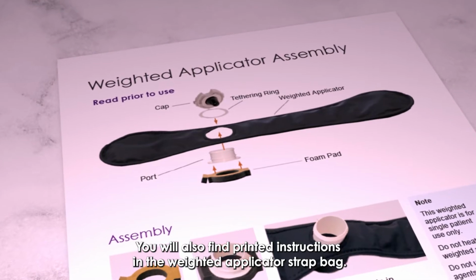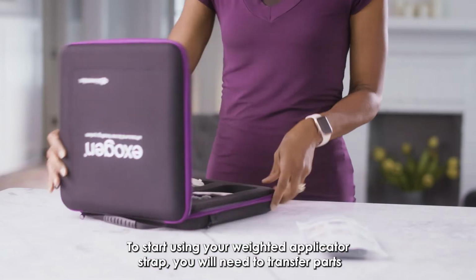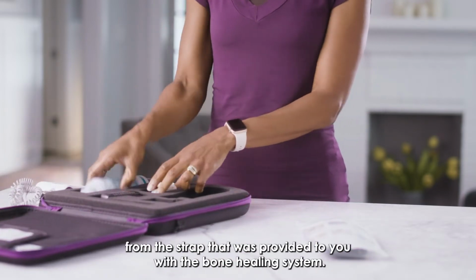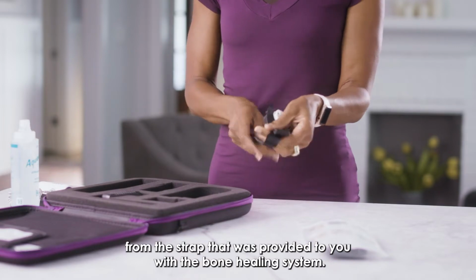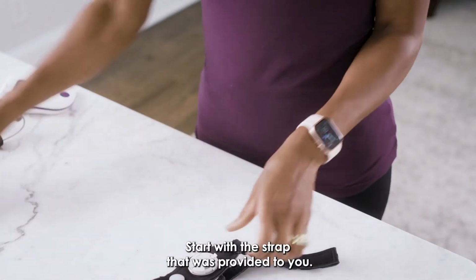You will also find printed instructions in the weighted applicator strap bag. To start using your weighted applicator strap, you will need to transfer parts from the strap that was provided to you with the bone healing system. Start with the strap that was provided to you.